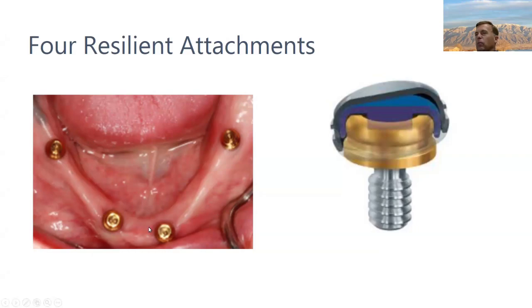This is an awesome restoration for patients with poor hygiene. I mean, if you can't keep this clean, I don't know what to tell you. But the one thing is, sometimes patients get a little frustrated with the little bit of sponginess to it, and there is a fair amount of maintenance. Normally you have to replace these little inserts about every 6 months, and the abutments about every 2 years.